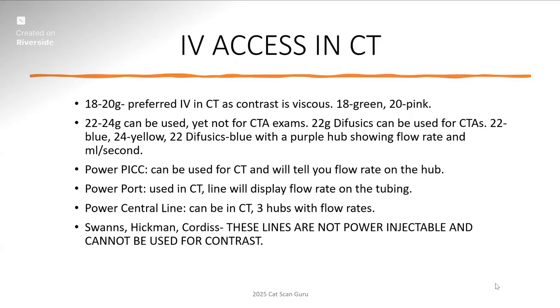Okay. And we even had a big debate at my hospital where we actually called the rep, and the rep sent us a voicemail back and said, absolutely not. They're only rated for 45 PSI. We know you guys inject at 300 or more. Please do not use this line for contrast injection because it has not been tested. It has not gone through the proper channels. You cannot use this.